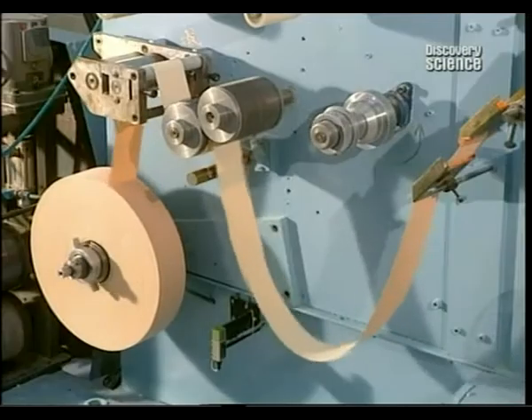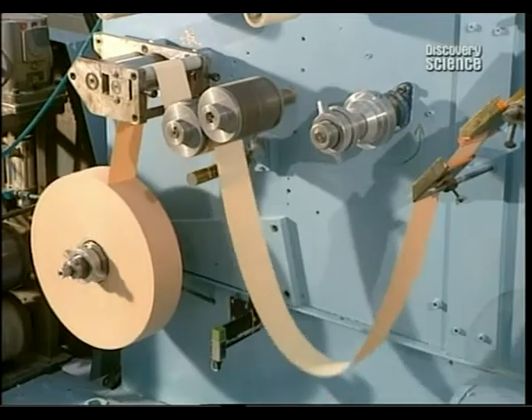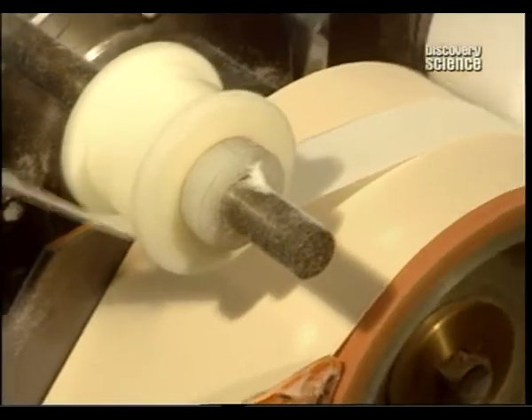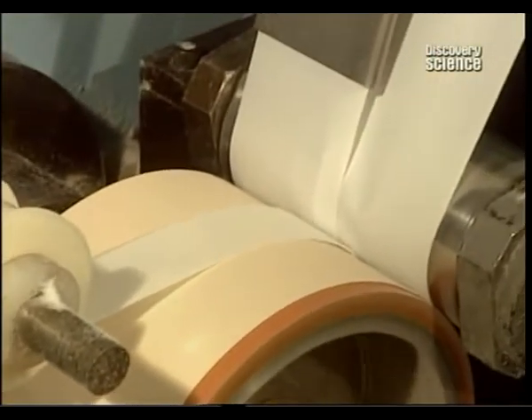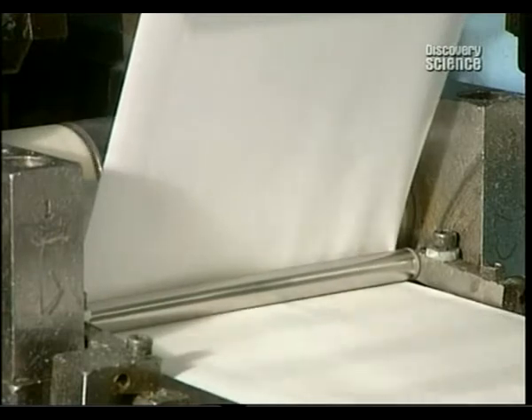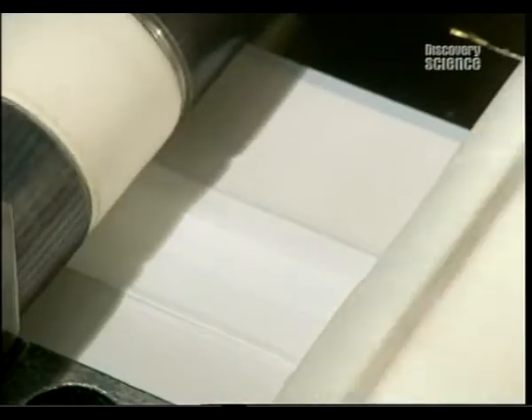The bandage components are unrolled. The machine assembles them, then cuts and individually wraps them. The unprinted white wrapping paper which protects the plasters is applied.